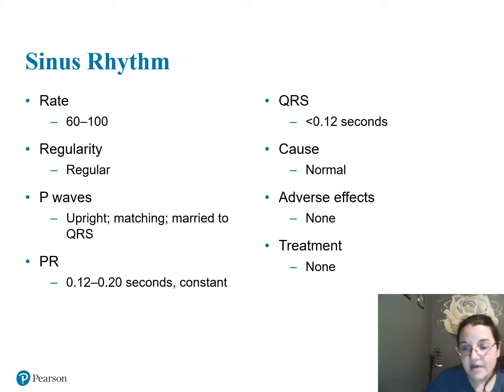So start memorizing them now, and don't memorize it, forget about it, and come back and relearn it. Every day or once a week, keep on reviewing what these rules are. Because right now it's only 1, but by the time we get to the end of this, there's going to be 33, okay? So the rules for my sinus rhythm.